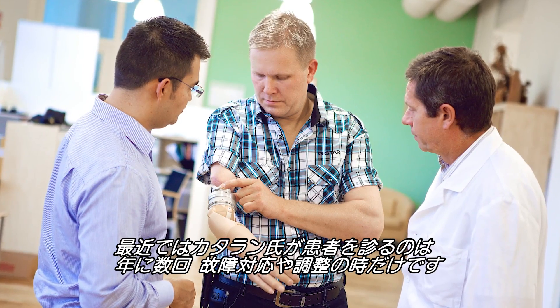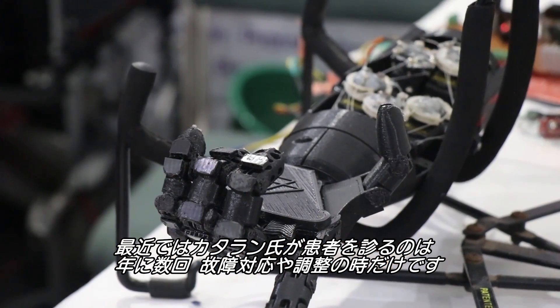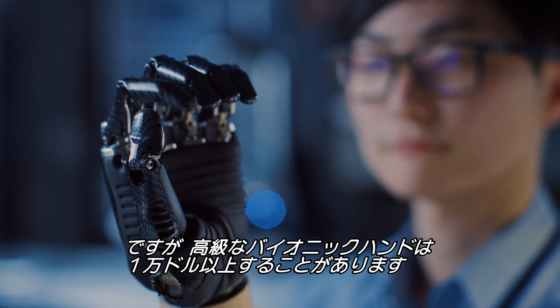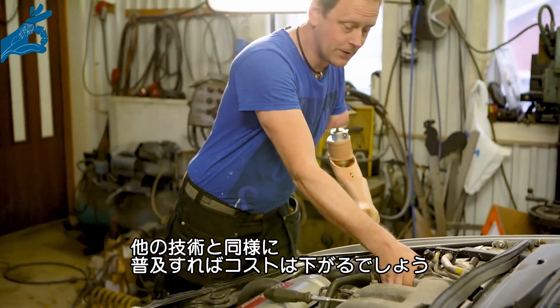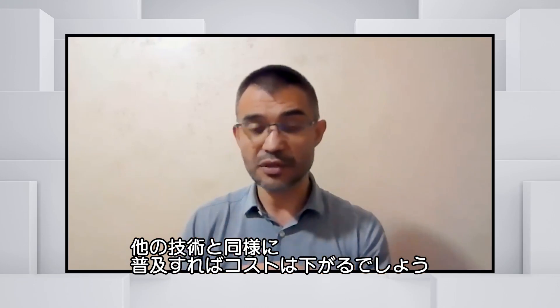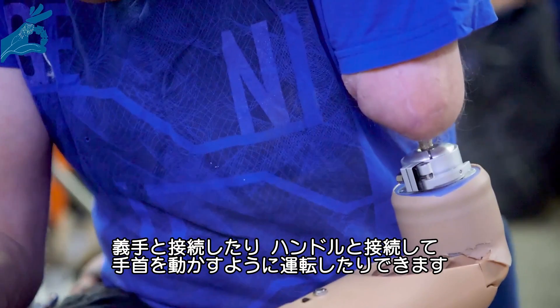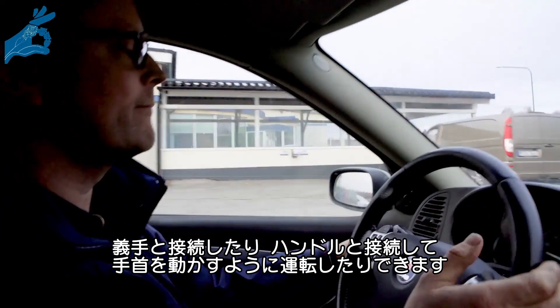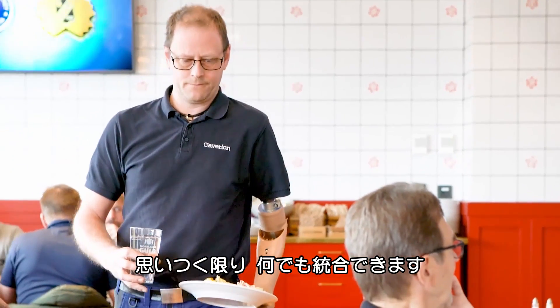These days, Dr. Ortiz Catalan only sees patients a couple of times a year when something breaks or needs fine-tuning. These high-end bionic hands can come with a price tag of over $10,000, but hopefully, like any technology, greater availability will reduce costs. A human-machine interface has been created, meaning the prosthesis could also connect to a car's steering wheel, allowing the driver to control it by thinking about wrist movement — integrated with whatever your imagination wants.